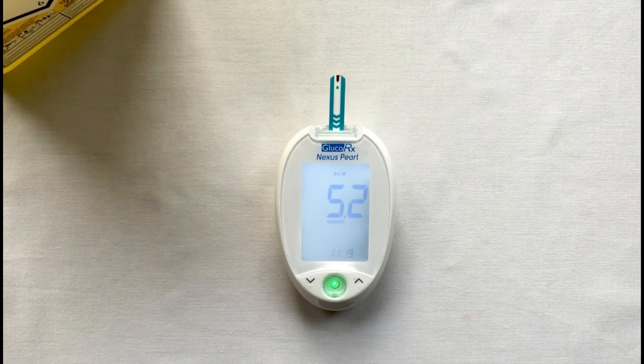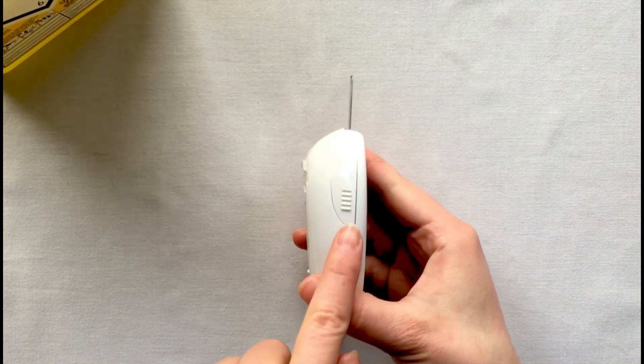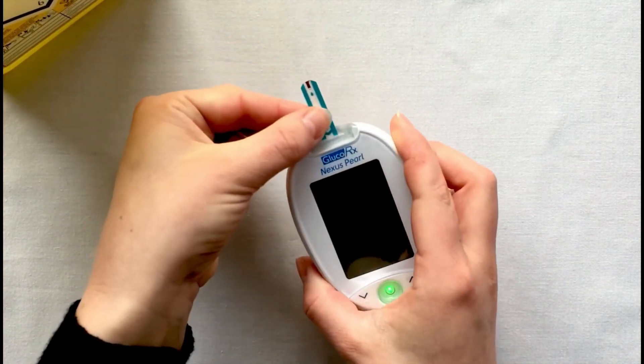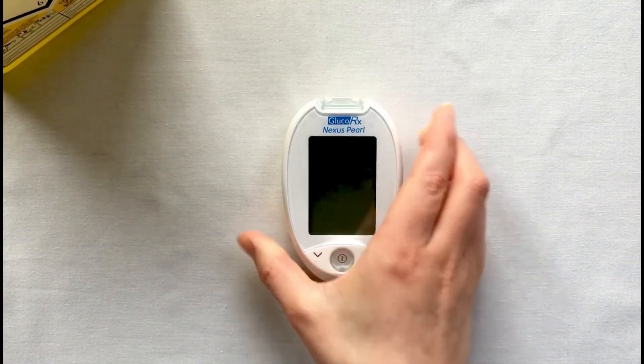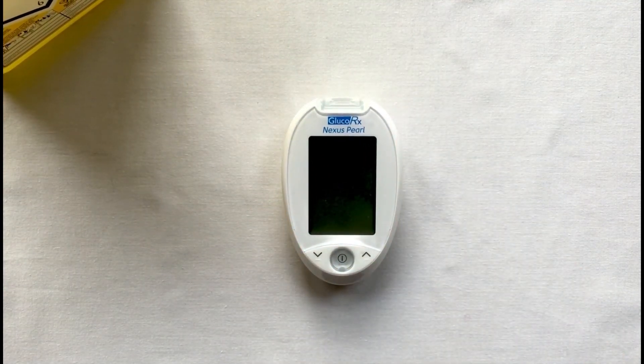You can either manually remove your test strip or use the test strip eject button. Please ensure you dispose of your strips and lancets into the safety sharps bin and your meter will automatically turn off.